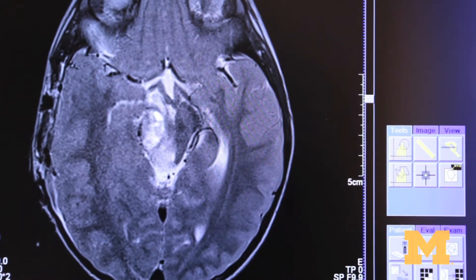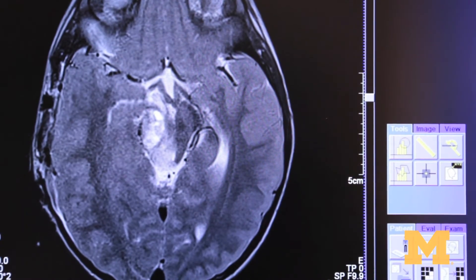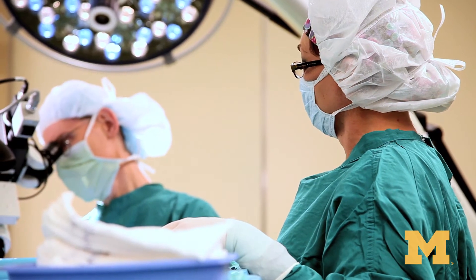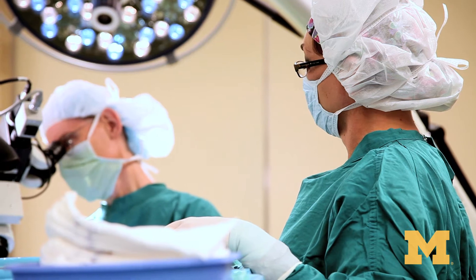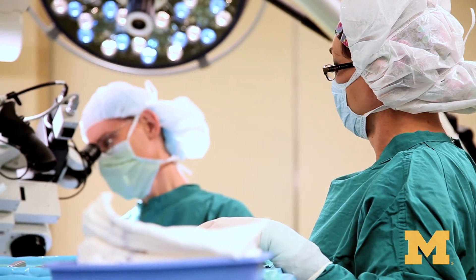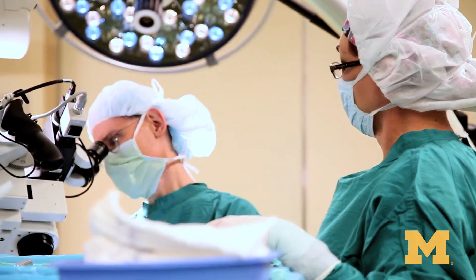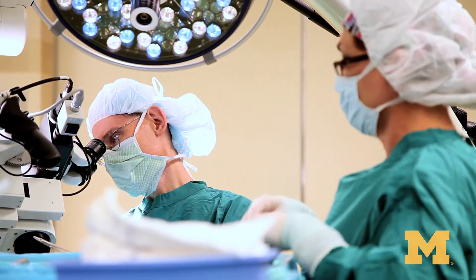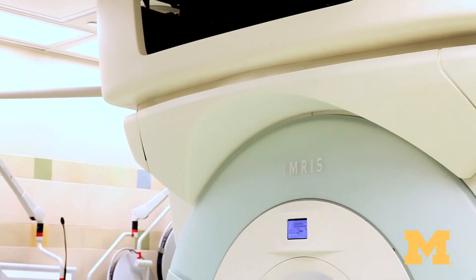But during the operative procedure, as we begin to remove tissue, the brain — which is soft — will change its shape. It'll move according to how the tissues are removed, so that the preoperative information is very quickly no longer accurate.